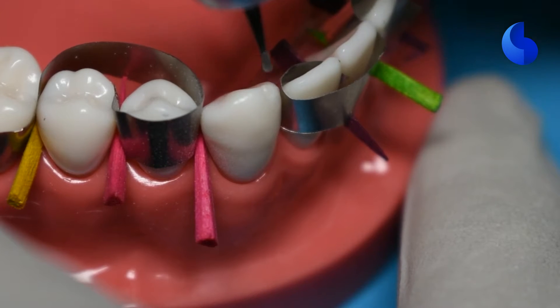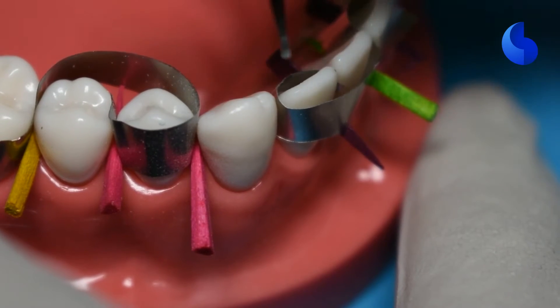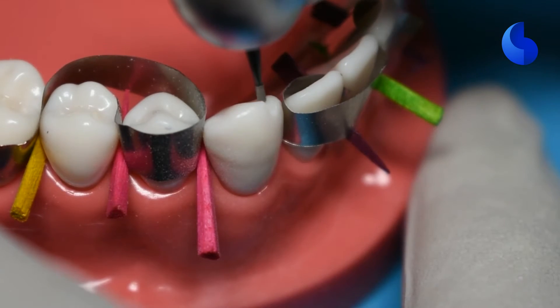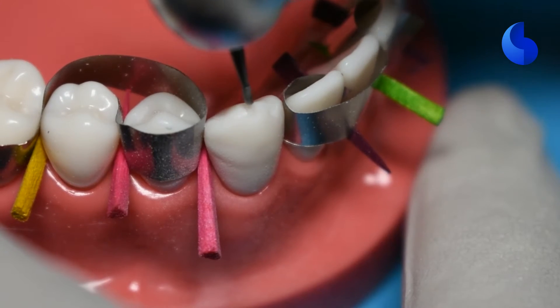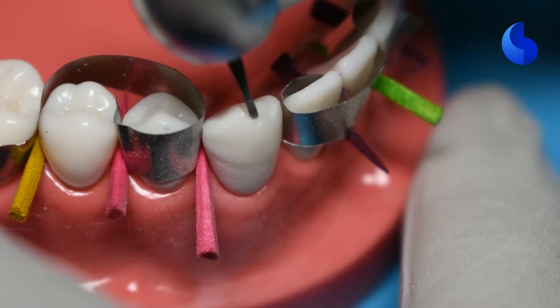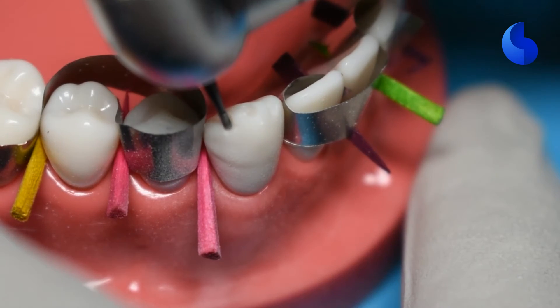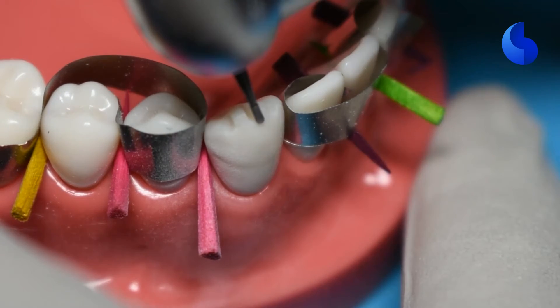We're going to start with the incisal reduction. An incisal reduction should ideally provide you with 1.5 to 2 millimeters of clearance. You can start off by placing two or three depth grooves in the incisal edge. Here we're using a 330 carbide bur to place those grooves. You can initially place it to about 1.3 millimeters, because you'll have additional loss of tooth structure when removing those islands and in the final finishing. So keep your depth grooves to about 1.3 millimeters. The height of a 330 bur is 1.5, so make sure that you sink it only three-fourths of its way — that way you know you're at about 1.3 millimeters.